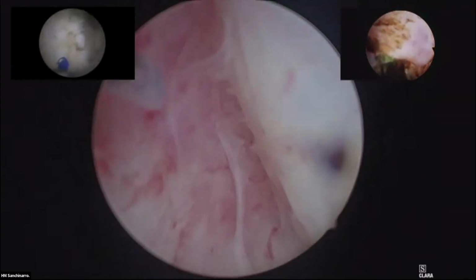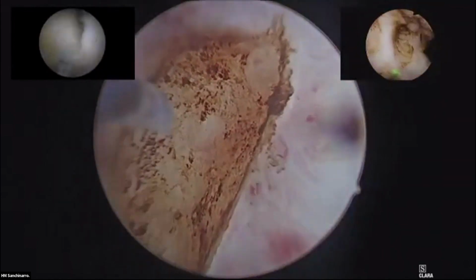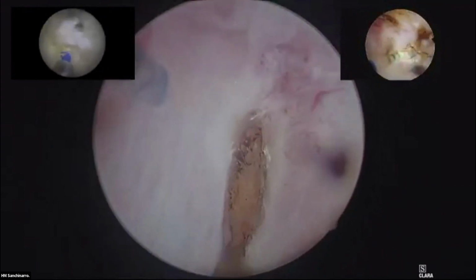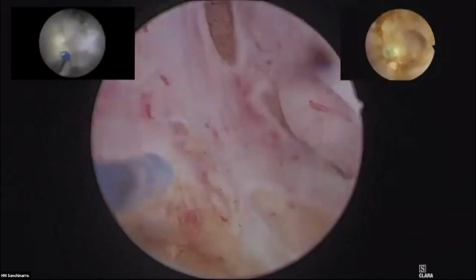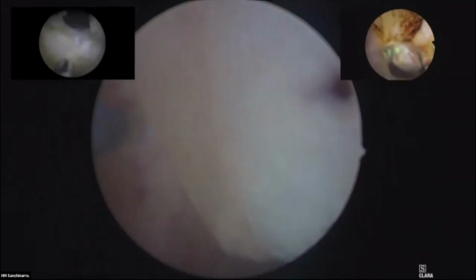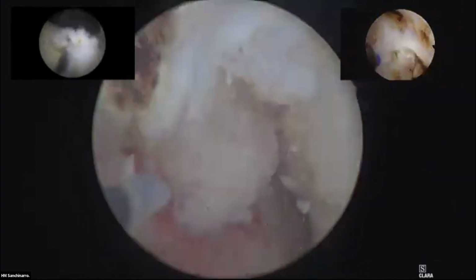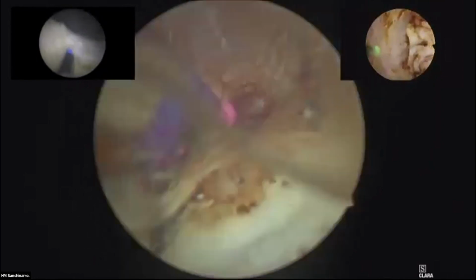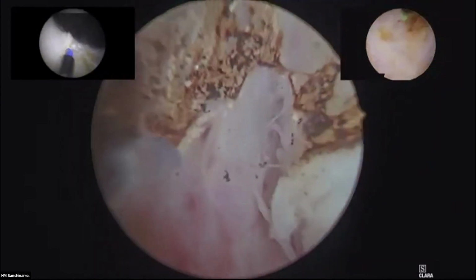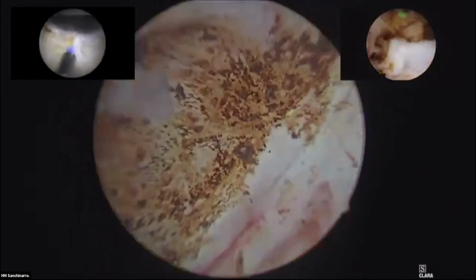So you just follow the mobilization of your first incision, and you are on the plane all the time. So you perform a little blunt dissection. Yeah, and then blunt dissection. You identify the correct plane and then the correct layer, and then you apply the thulium laser just to cut when it's hard to dissect, for the traction and for coagulation. So you do coagulation while you're cutting, and that's it.